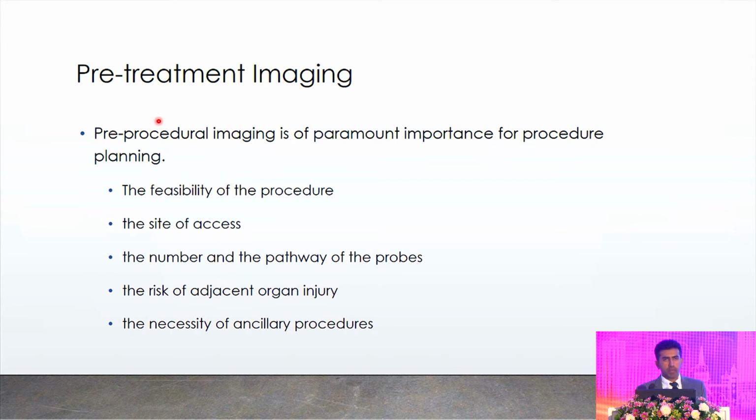Pre-treatment imaging is very important to assess the feasibility of the procedure, the site of access, the number and pathway of the probes, and the risk of adjacent organ injury. This is very important to reduce the complications of ablation, and the necessity of ancillary procedures.